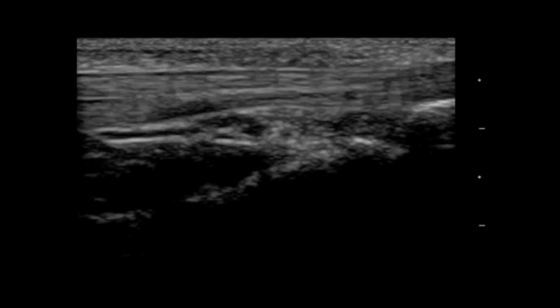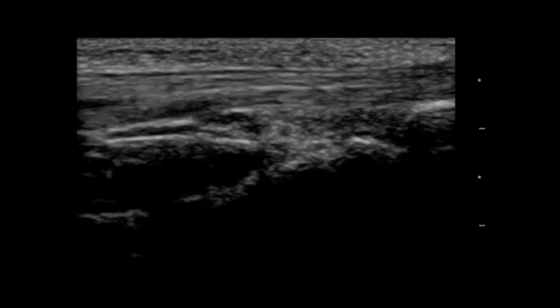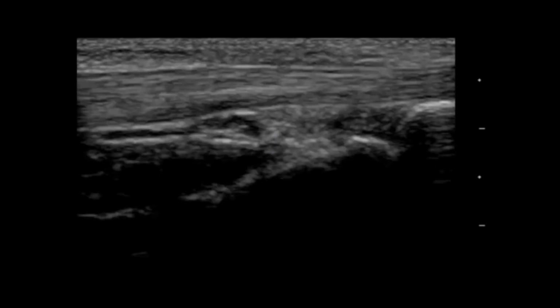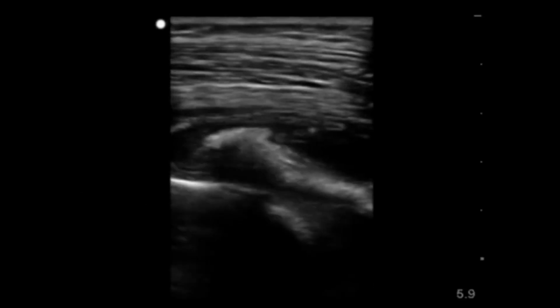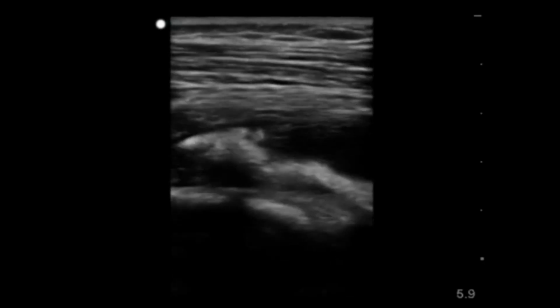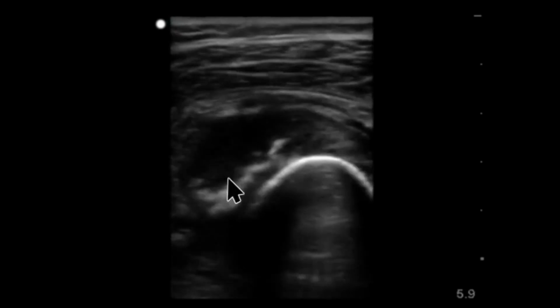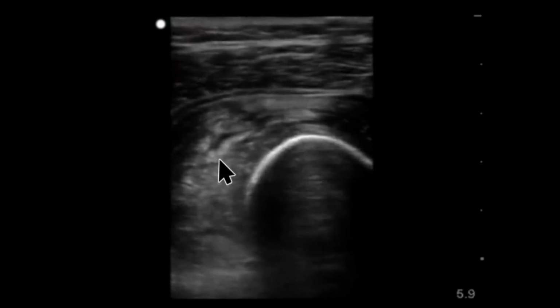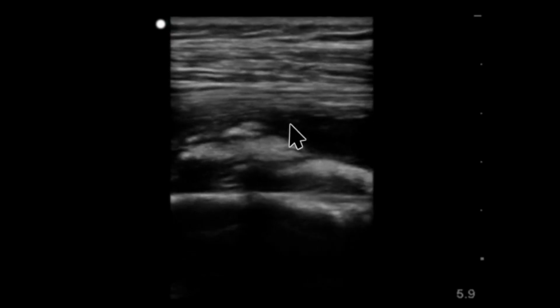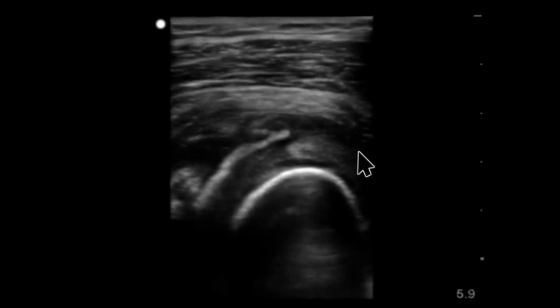Here is a tendon taken through its range of motion. As the joint is ranged, one can see this tendon demonstrate a homogeneous and very hyperechoic appearance as it slides upon its plane. Here's a patient who has a hematoma in his thigh. One observes all this hypoechoic debris seen over here as the hematoma. When we stretch it out into the long axis, we can see this hematoma here stretching out across the screen. This is hypoechoic debris.